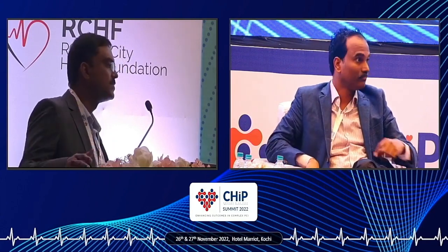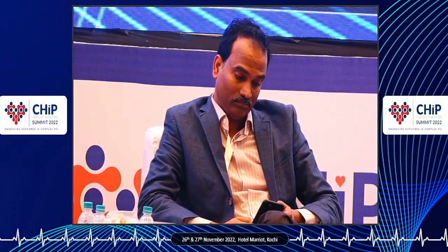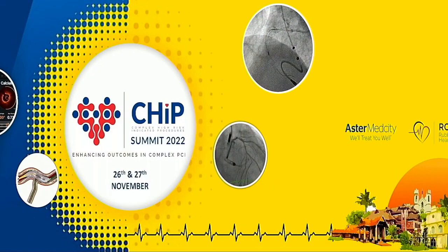You have a situation wherein you have crossed a CTO with a wire, you have no imaging available, and you have both the laser and rota available. What will be the choice? Obviously, laser. Rota has the stent ablation. No, there is no stent. This is a native CTO lesion. You have crossed the lesion, no balloon is going, no imaging is available, and you have both the options.